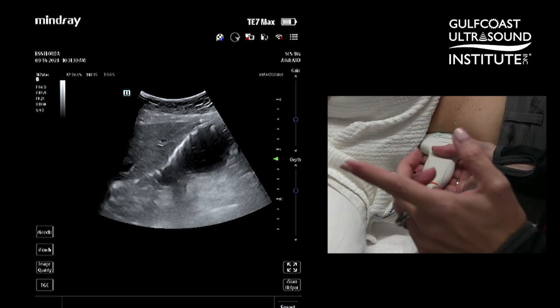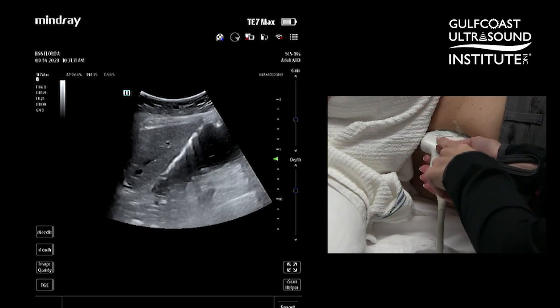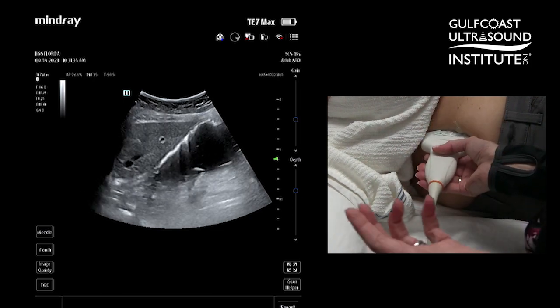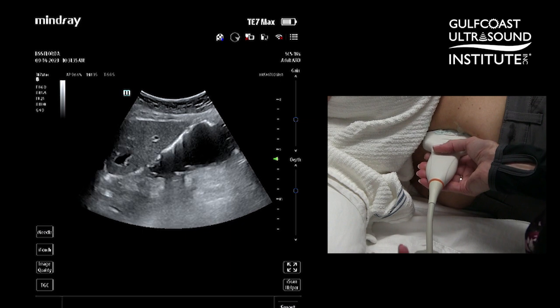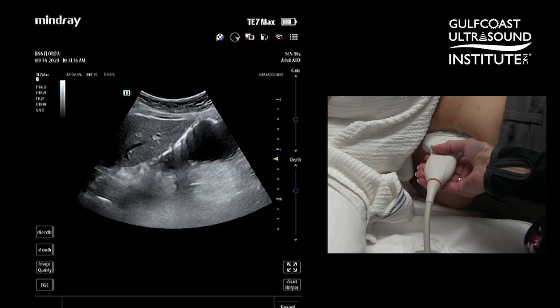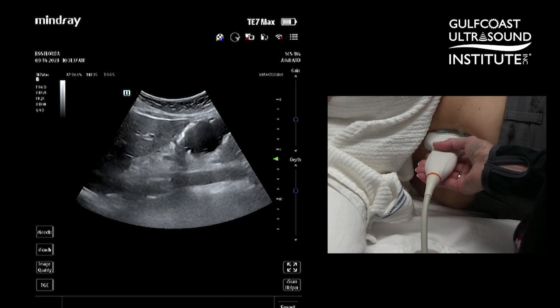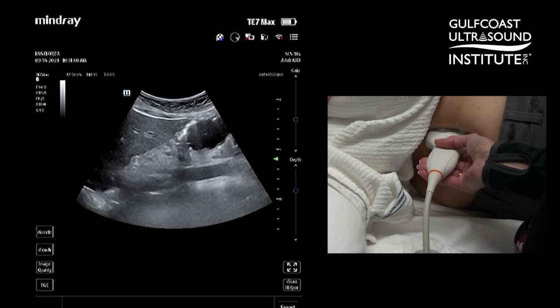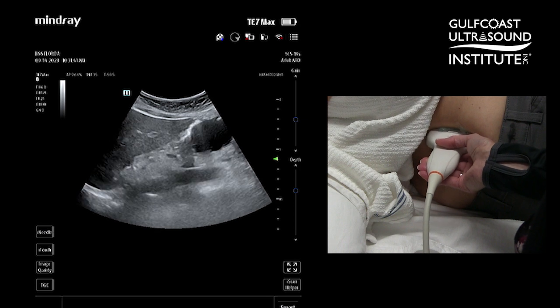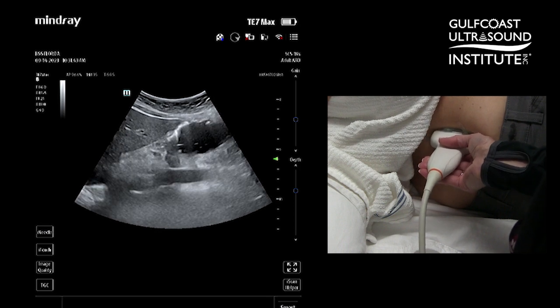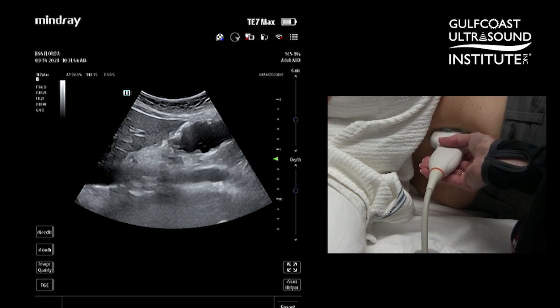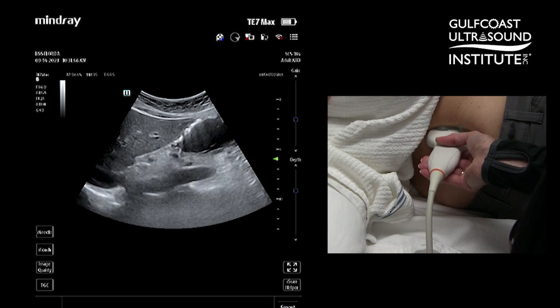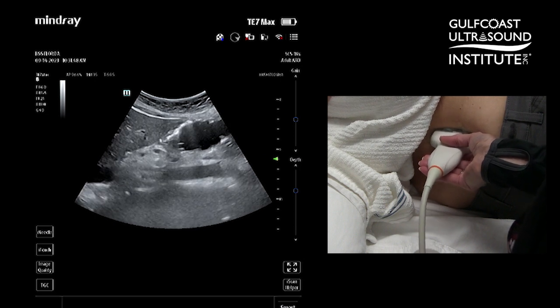For probe placement, you'll use your curvilinear transducer placed in the longitudinal orientation at the level of the aorta. Come up superiorly and you're going to see the gastric antrum, which is fluid-filled here in our model, snug up right next to the medial portion of the liver.